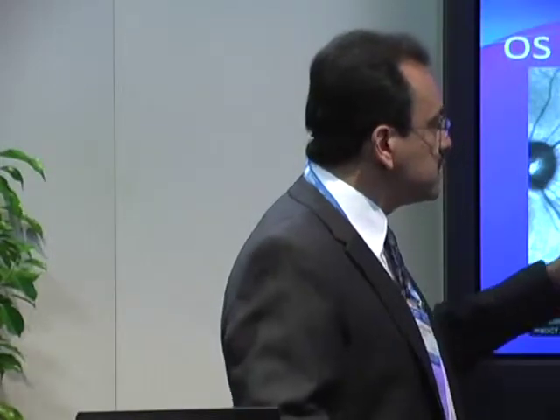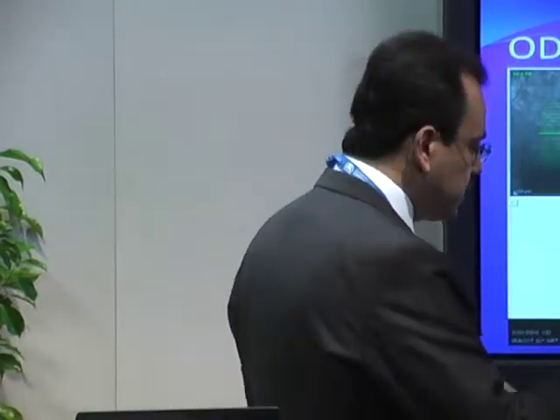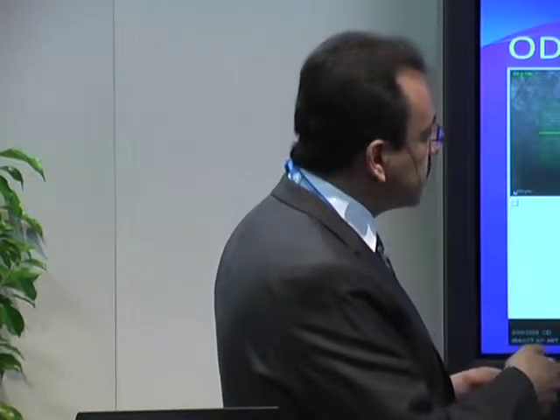And I think that this example also shows us what happens with the OCTs in diabetic macular edema. If you recall, the DRCR.net published a study in which they demonstrated that OCT thickness really did not correlate well with visual acuity in patients with diabetes. And the same issue: what determines your visual acuity isn't necessarily that you have cystic changes here, but what the health of your photoreceptor layer is doing. And I think that's going to be important in terms of monitoring these patients.